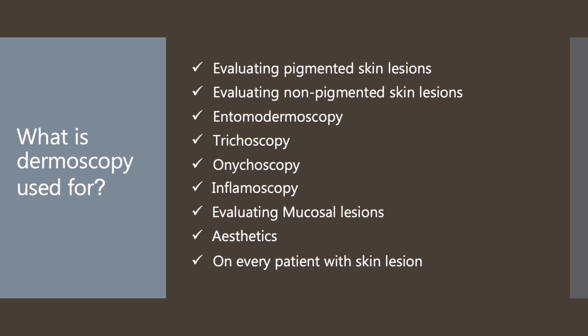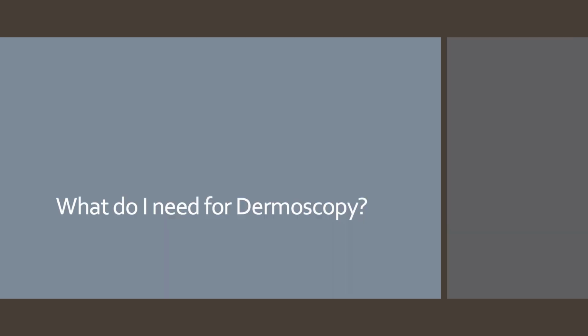There are so many uses of dermoscopy in dermatology. It can be used for evaluation of pigmented and non-pigmented skin lesions, for entomodermoscopy, which is the evaluation of skin infestations with the help of a dermatoscope, trichoscopy to see the hair, onychoscopy for nails, inflammoscopy for inflammatory skin lesions, for evaluation of mucosal lesions, in aesthetics, and in fact, on every patient with a skin lesion, you can do dermoscopy. What do you need for dermoscopy?